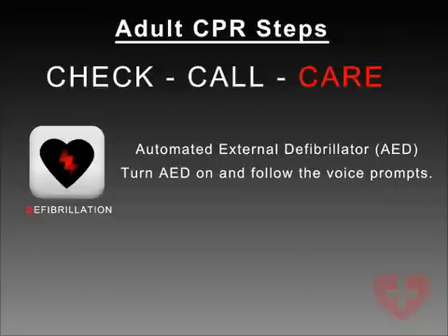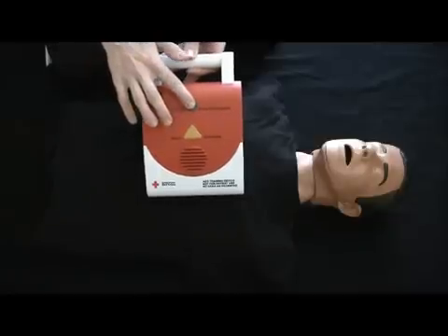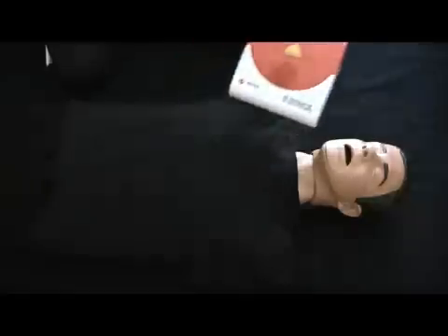Turn AED on and follow the voice prompts. This is a training device only. No shock will be delivered.